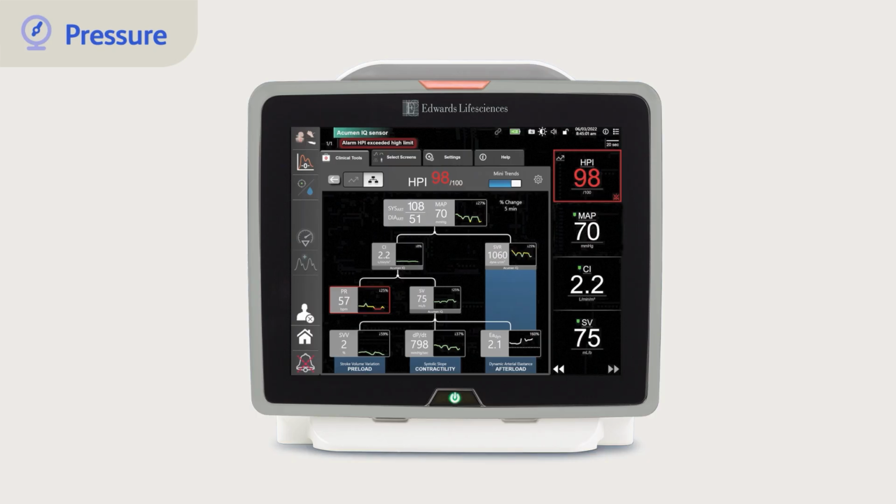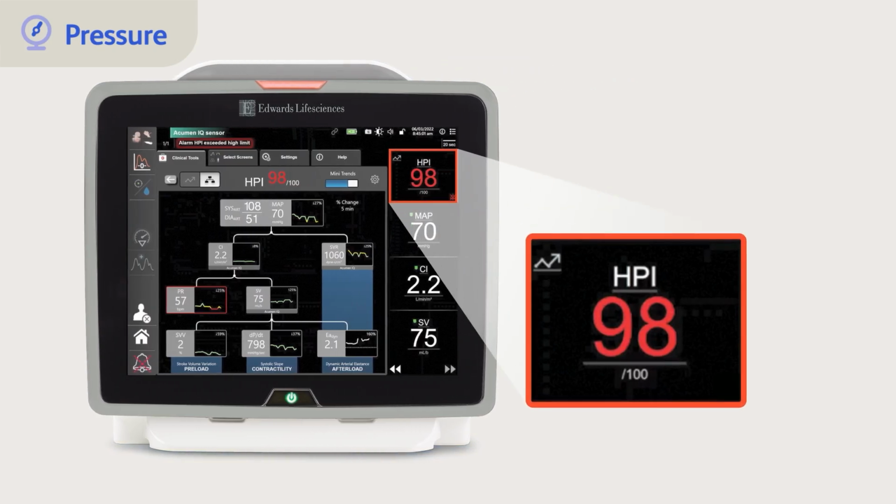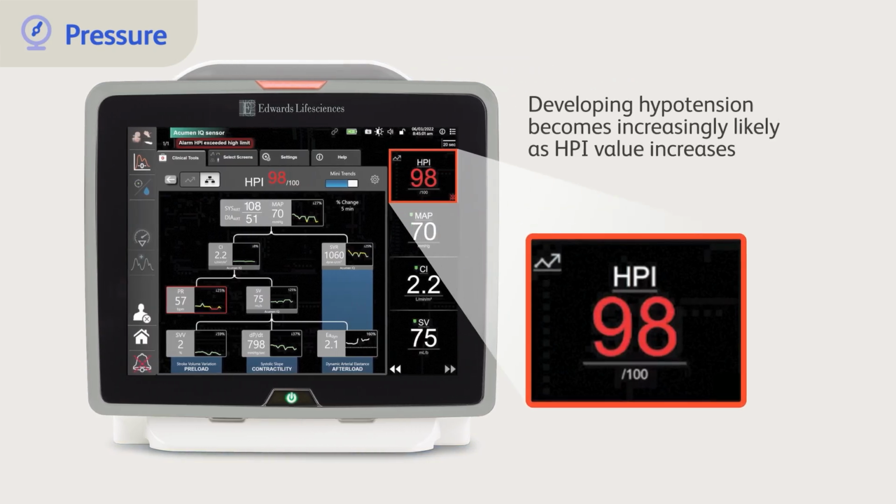Now I'd like to turn your attention to the HPI parameter. As this number rises closer to 100, the likelihood of the patient developing hypotension becomes increasingly likely with a sooner onset. An HPI value greater than 85 means there is a high likelihood of the patient becoming hypotensive soon. In my practical experience, it's not necessary to wait until HPI value is high. A significant rise in the number is warning you that the circulation is potentially unstable.